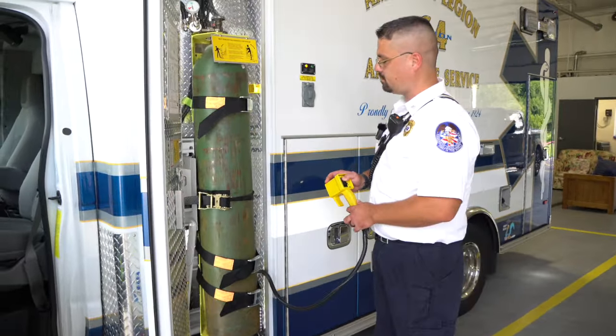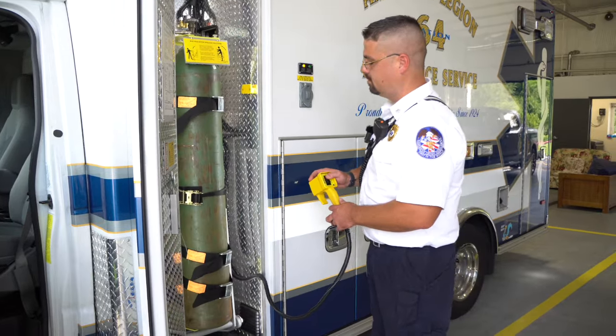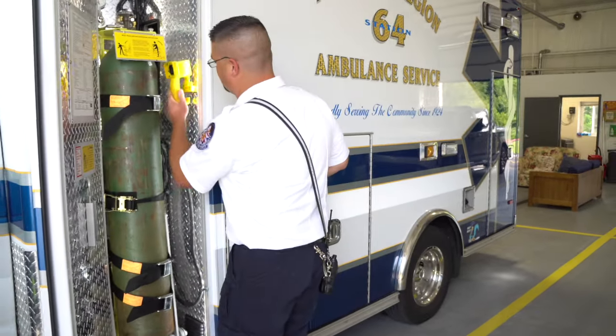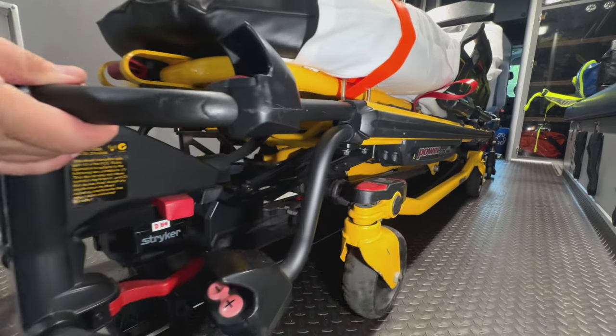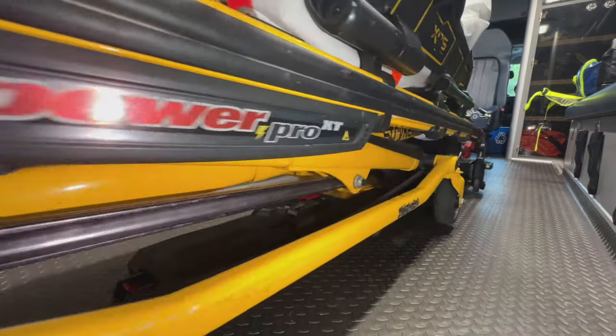I've been doing this for about 31 years, and the things they've come up with — power systems for loading, and even the power stretchers — make a real big difference. It's probably put another 10 years on my service before I have to retire.